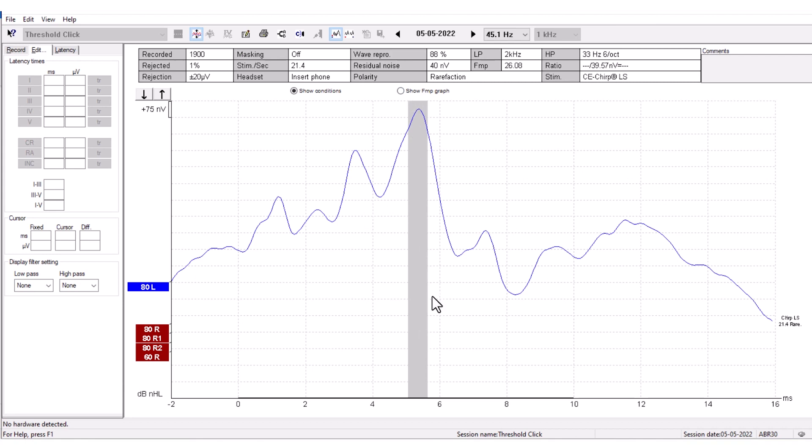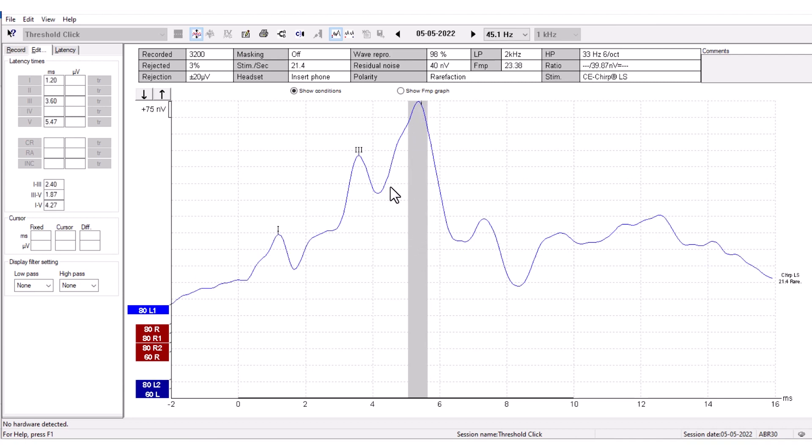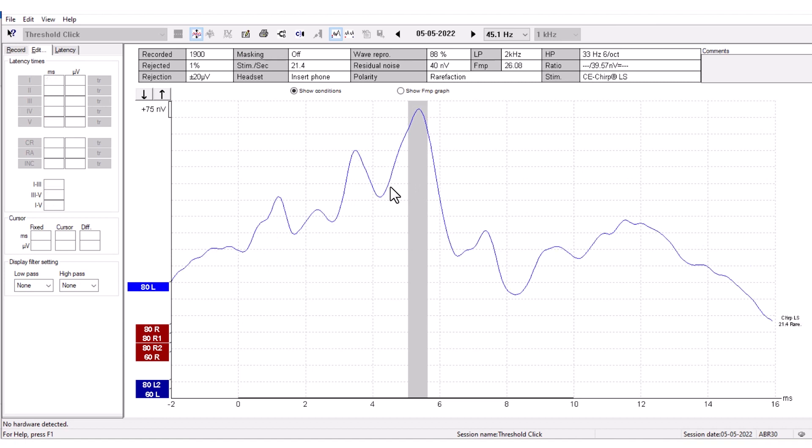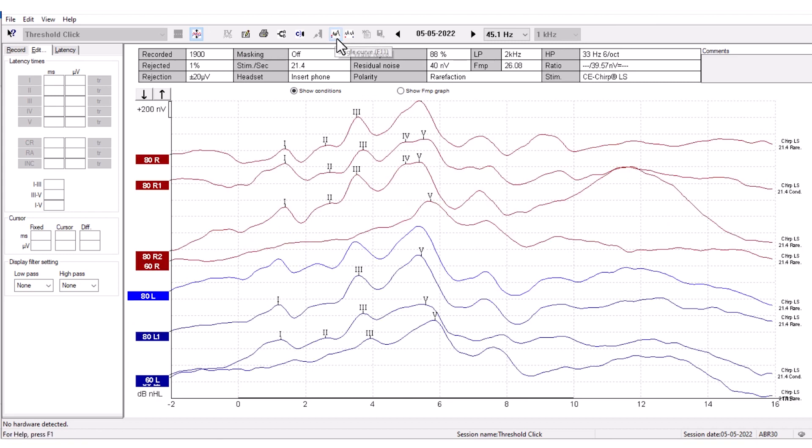This gray bar shows the normative data for the fifth wave marker. You can browse between measurements with the Tab key, or you can click the single curve view again to stack all the ABR measurements that you have performed.